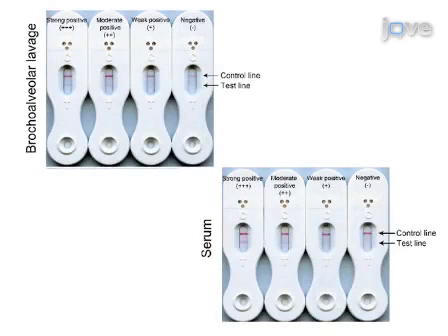Ultimately, the lateral flow device is used to detect the presence of Aspergillus diagnostic antigen in serum or BAL fluids. The Aspergillus LFD can be used as an adjunct test for the diagnosis of invasive pulmonary aspergillosis.